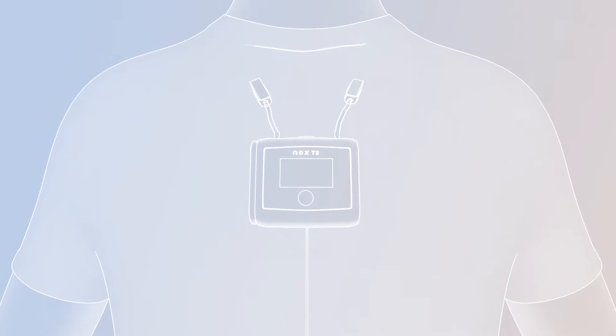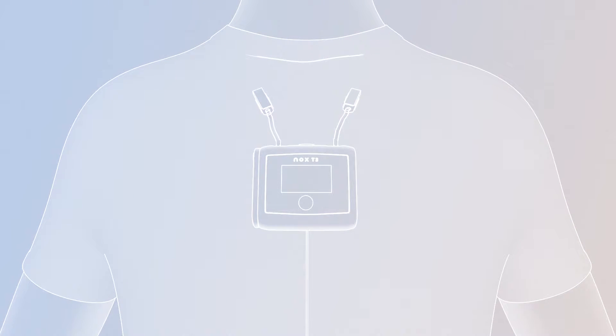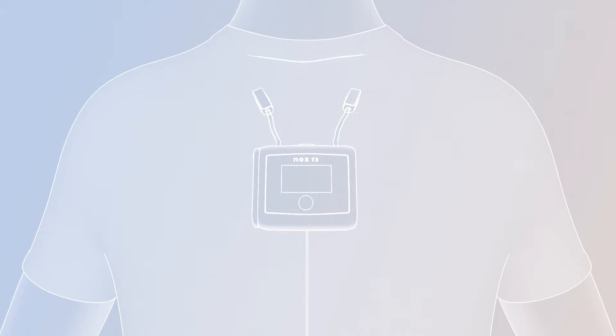Snap the two clips of the T3 device close to the collar of your t-shirt so the T3 device sits on top of the chest, and make sure the device display faces forward.